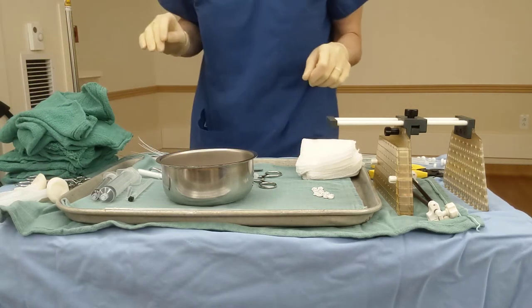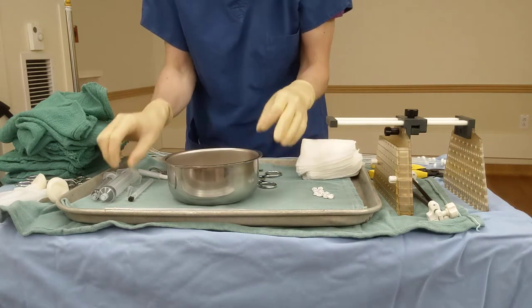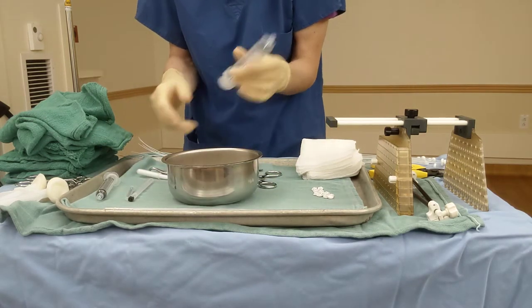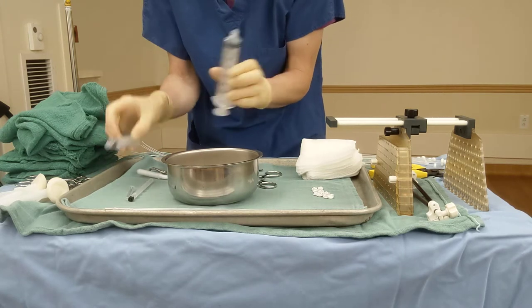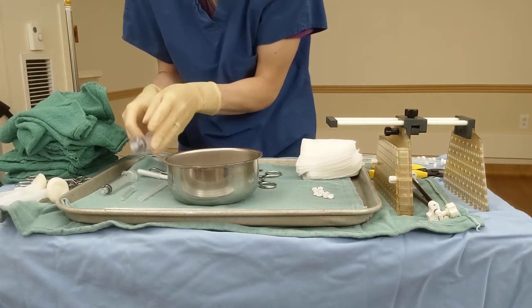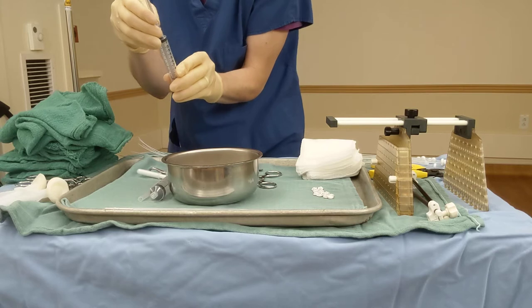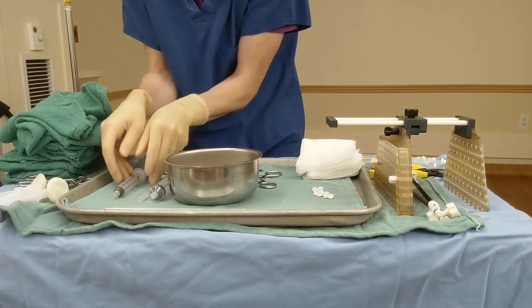We have a bowl that's going to have some local anesthetic in it that we are going to drop into these syringes — a 30cc and a 10cc. The 30cc is going to get attached to a spinal needle for numbing the breast tissue. The 10cc is going to get attached to just a little needle for numbing the skin.